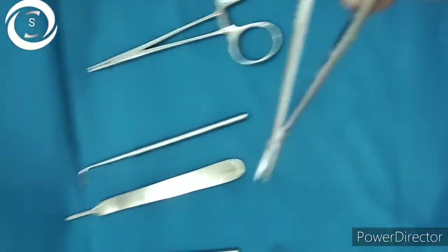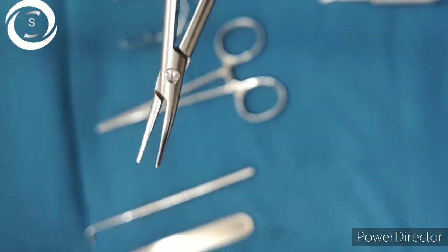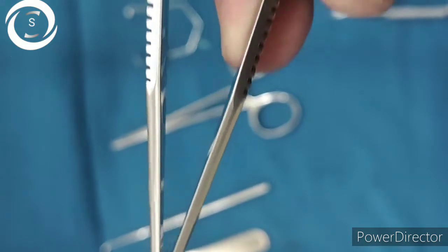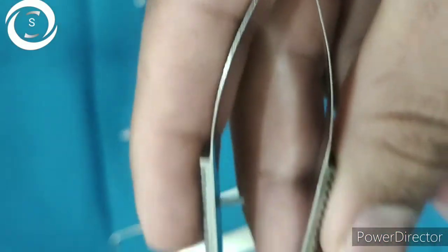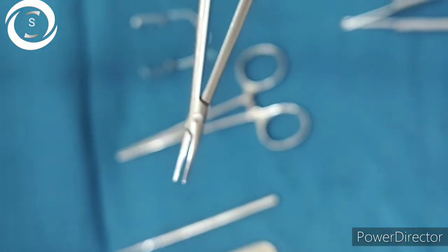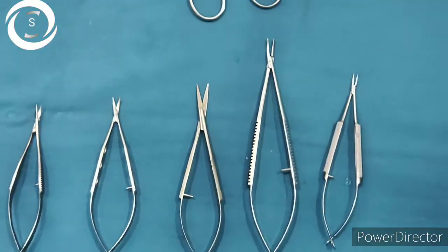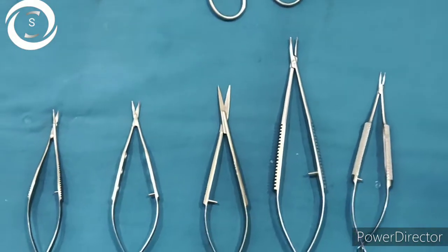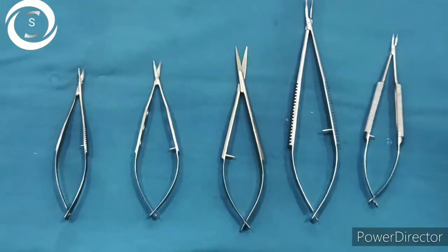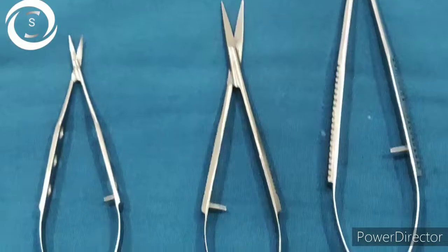If the tip is curved, it is called the Barraquer curved needle holder. You can clearly see there are no sharp edges on the blades. This is the large needle holder — again the tip is straight, so it is called the Castroviejo large needle holder. Hold it like a pen. It is used for squint, DCR, and lid procedures when a large needle needs to be held.